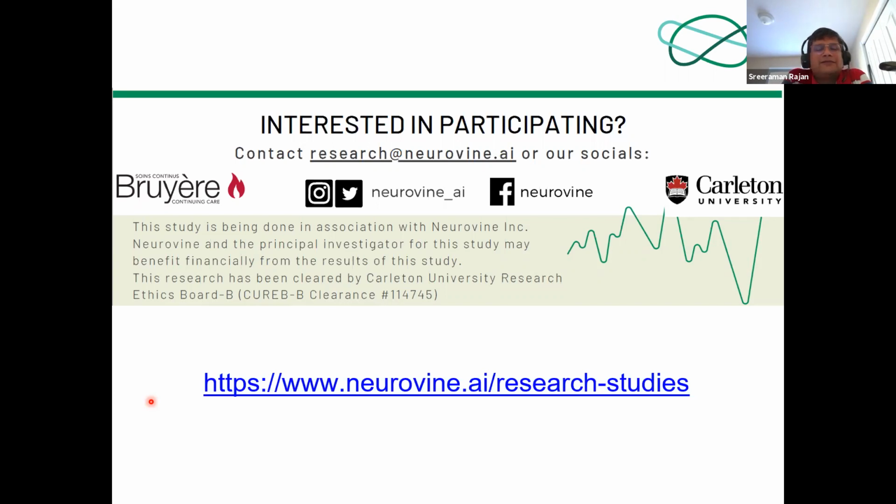Yeah, so to handle the low signal to noise ratio, the EEG signal needs to be clean. It has sources of biological noise and environmental noise, movement, such things. Bad epochs have to be removed. So at Neurovine, we've created a classifier that identifies when the EEG is clean. That is, when we know for sure that this epoch is purely brain signal. The other part of your question is variability. How do we deal with variability?